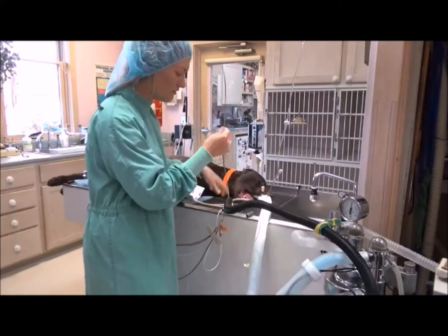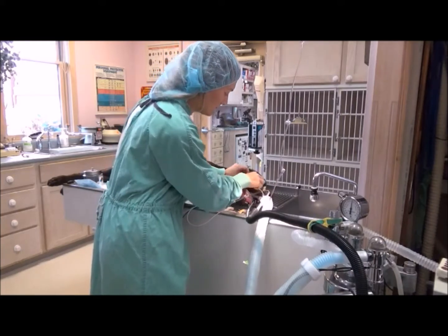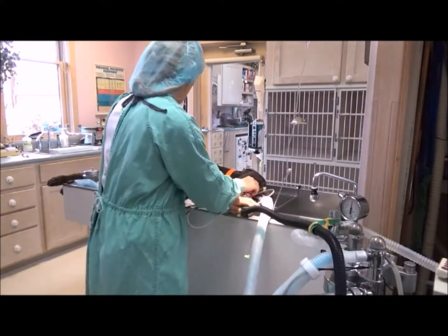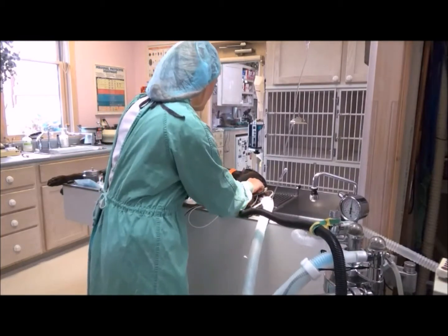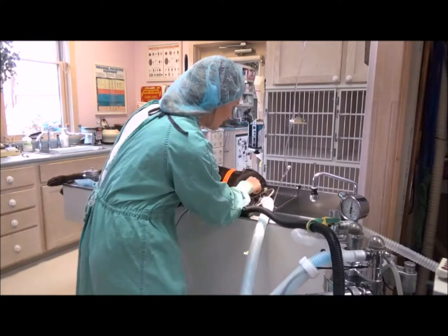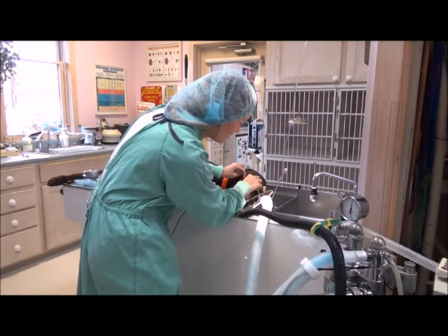The temperature probe, you want to insert this in the mouth, down the esophagus. A proper temperature for a dog or cat should be between 100 and 102.5.